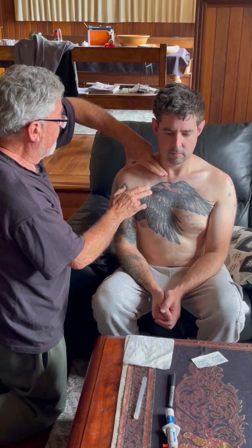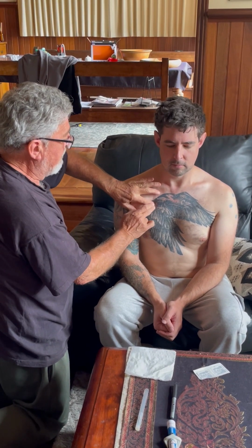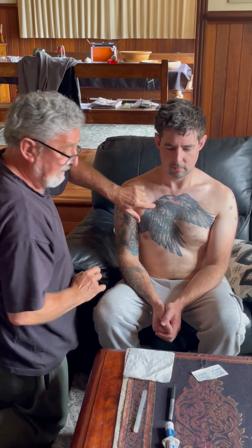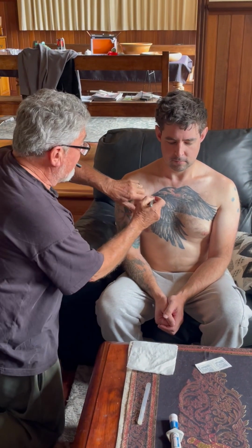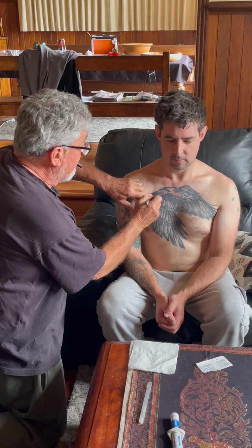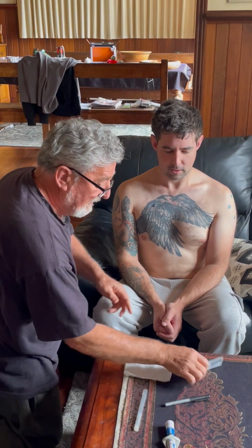So that's the whole clavicle right here to the shoulder. So up around here, we're quite happy with that, and we feel the third rib just underneath there. What we can do is mark the area. Okay, do it across there, mark the area where we're going to insert.